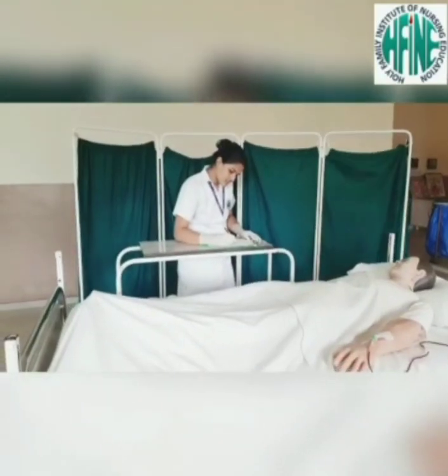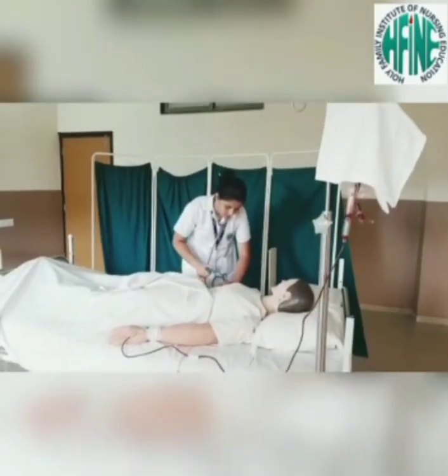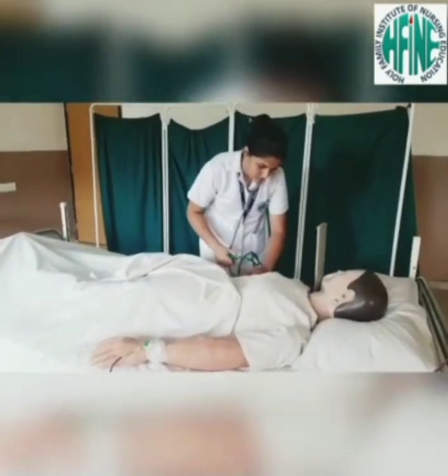The first 15 minutes is when most transfusion reactions can occur. Increase the rate of transfusion after this period if the patient is stable and does not display signs of a transfusion reaction. Monitor vital signs after 15 minutes, then periodically, and finally at the completion of the transfusion.